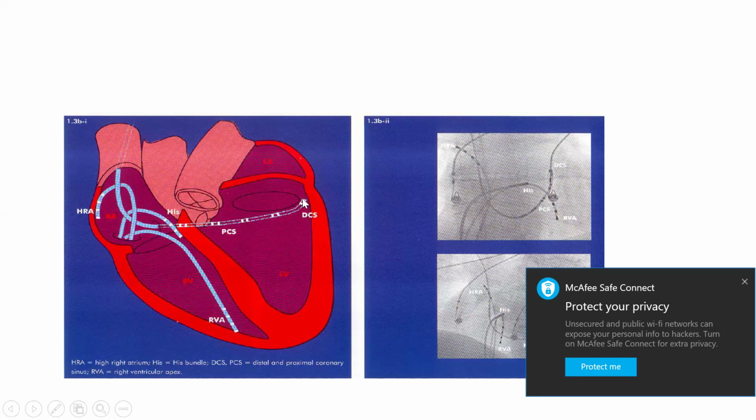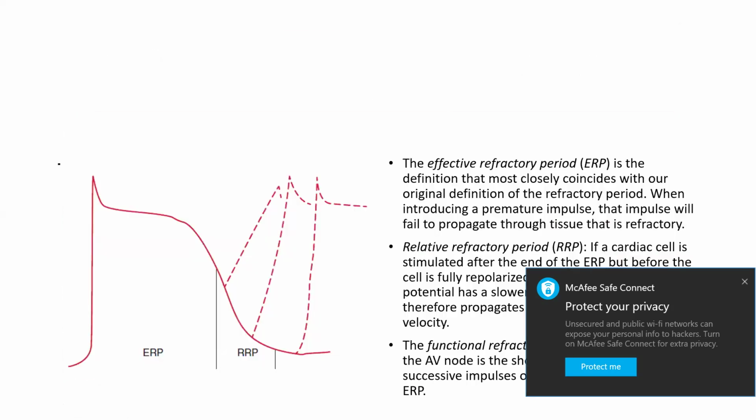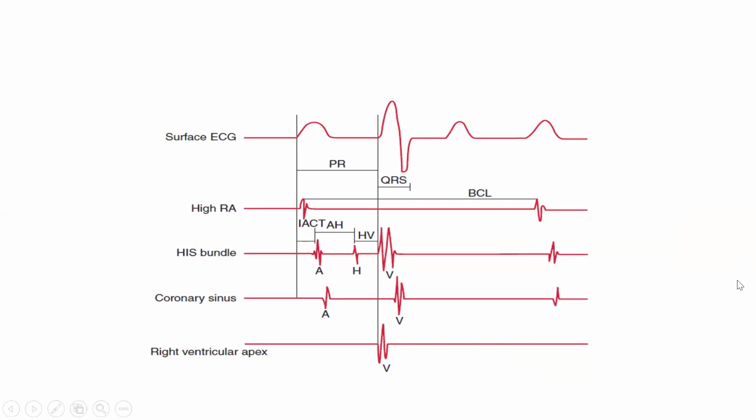Anytime you are seeing 1, 2, it's at the far lateral wall of the left atrium and ventricle. I hope it's clear. You can now understand why the CS catheter can capture both the atrium and the ventricle.